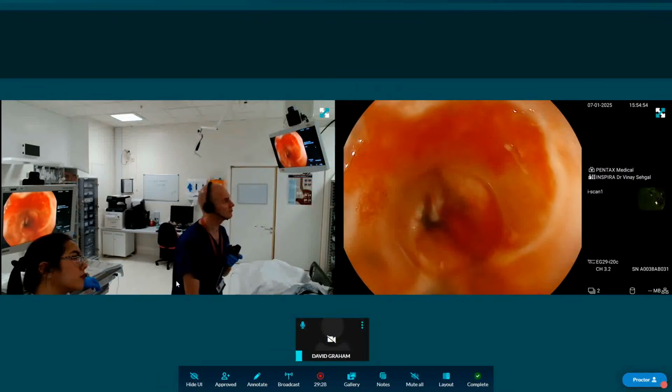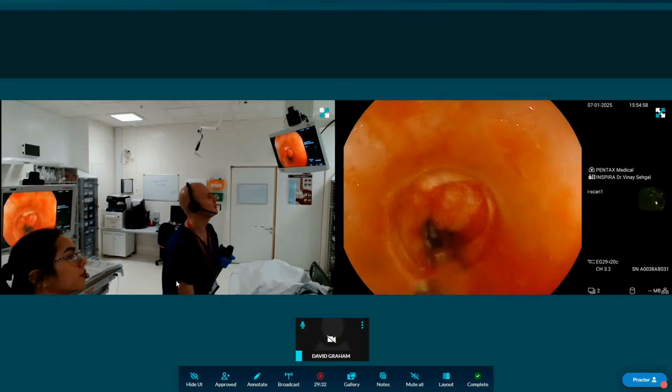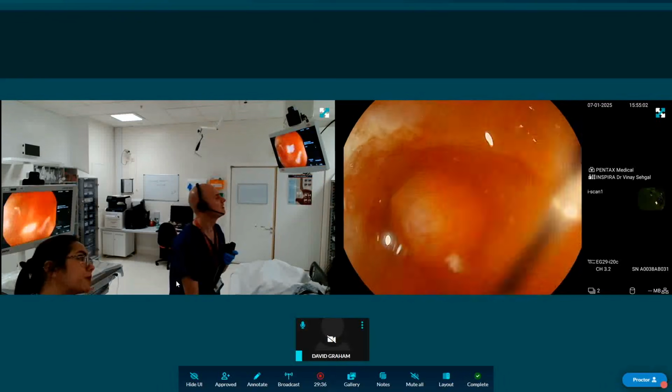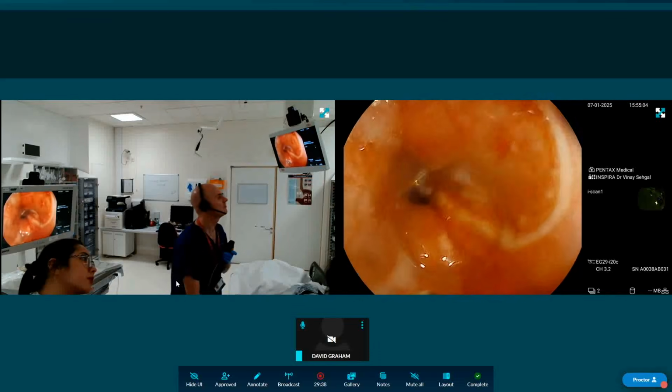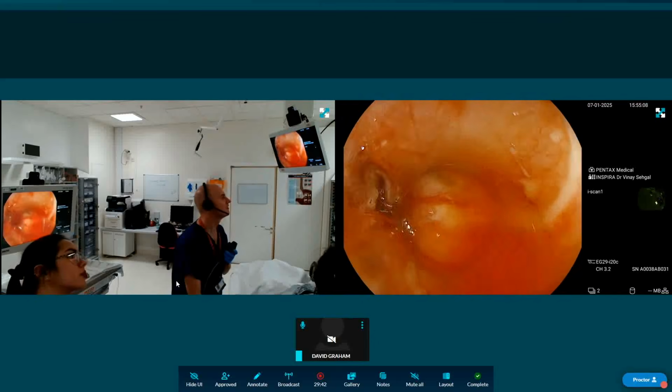Might have got it. Let's have a look. We're just going to do a bit of a wash. Looks like it might have done. Looks good, doesn't it? Let's have a look. So we just check that we're happy. There's no fresh bleed in there. That's on this side. That's very nice.